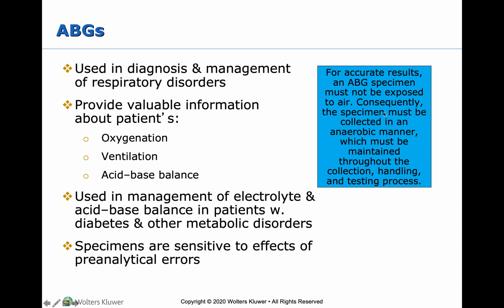Okay, so that's what this means over here. Consequently, the specimen must be collected in an anaerobic manner. So anaerobic means without air. Must be maintained throughout the collection, handling, and testing process. So it cannot be exposed to air. It must be kept closed in the syringe.